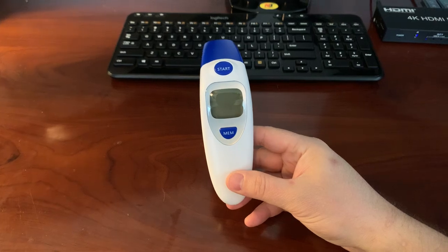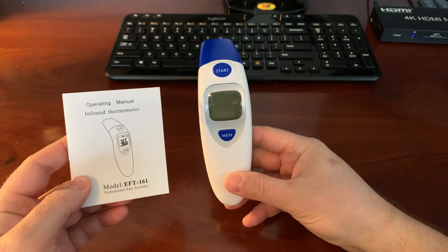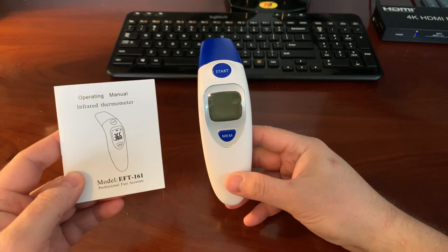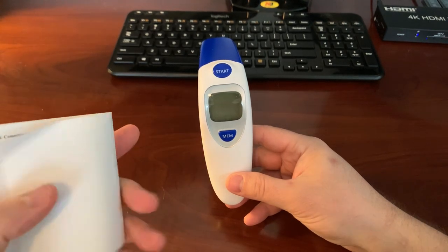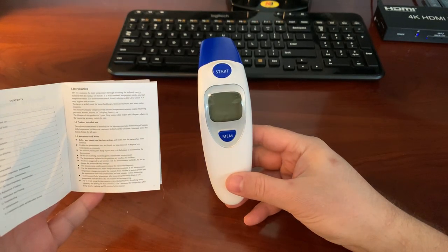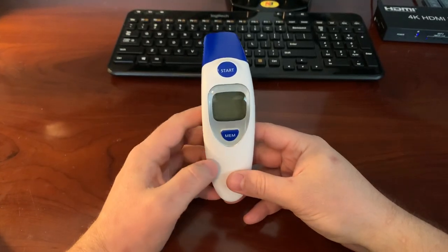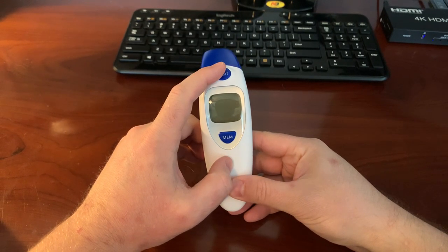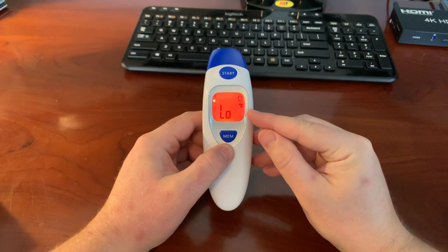Hey YouTube, going to make a quick video on this non-contact or ear thermometer I got on Amazon, model EFT-161. I'll give you some screenshots of this manual in case you don't have it. One thing I was noticing — it's a good thermometer, but I was struggling when I replaced the batteries.